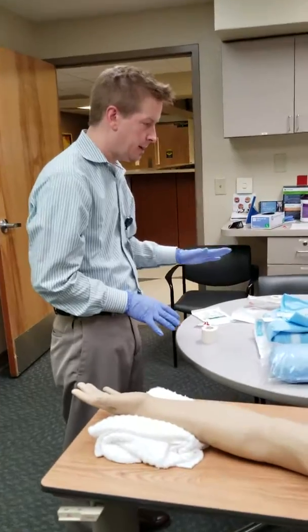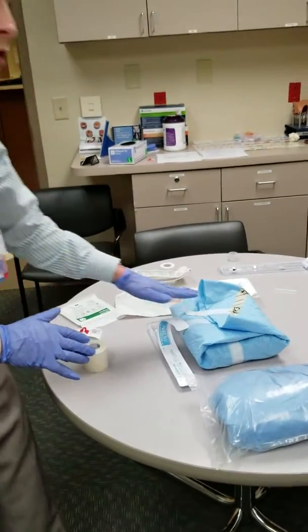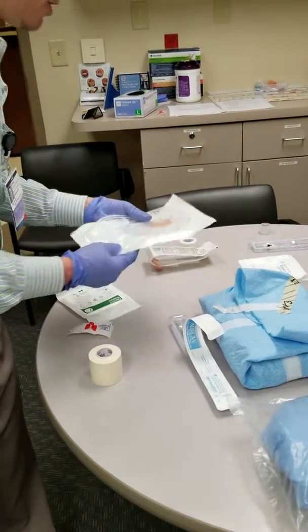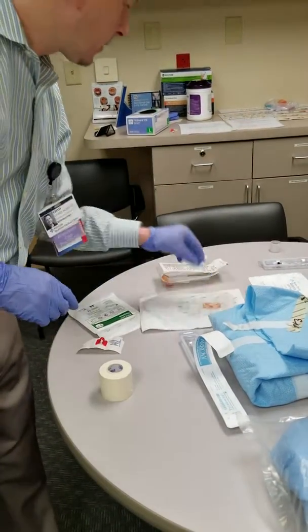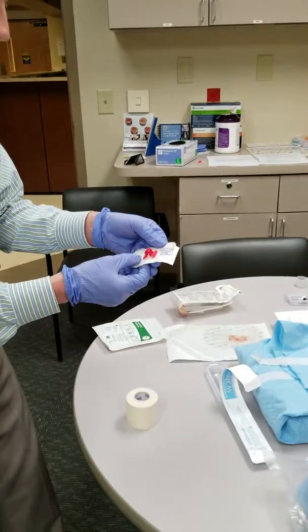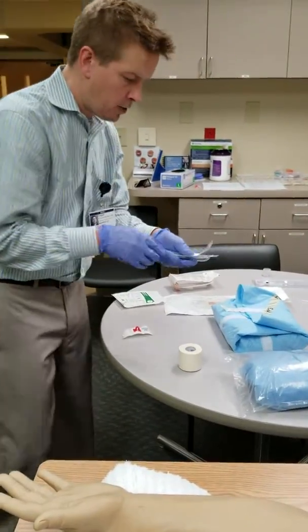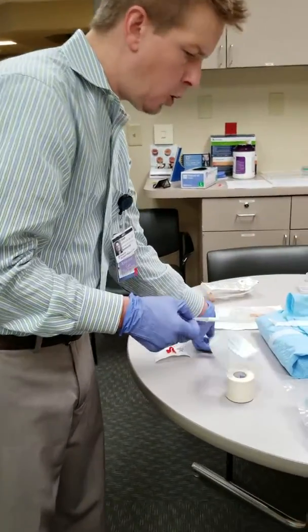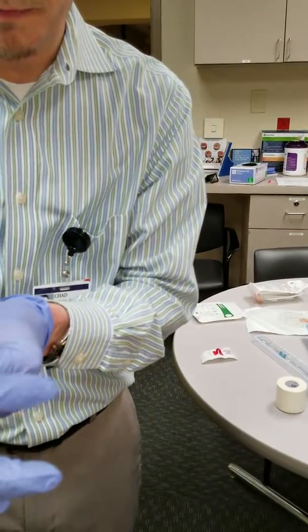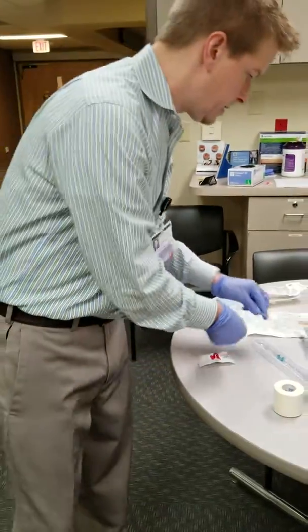We utilize a sterile technique here. Here is our equipment: a sterile gown, four sterile towels, a boat of 4x4s, a Tegaderm with a microbial patch in the middle, Chloroprep or chlorhexidine, sterile gloves. The securement device is the StatLock and the foam tape. The Arrow system that we use here is an all-in-one — it houses the guide wire, the sheath, and the needle all in one. This is a pretty slick little deal.